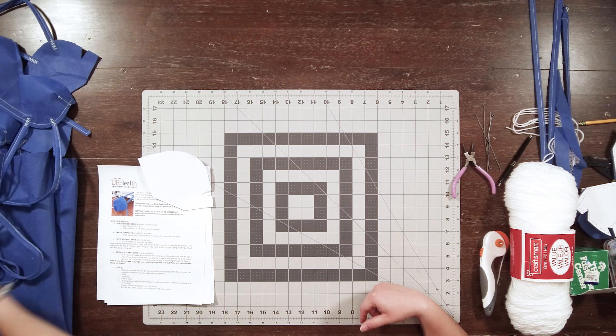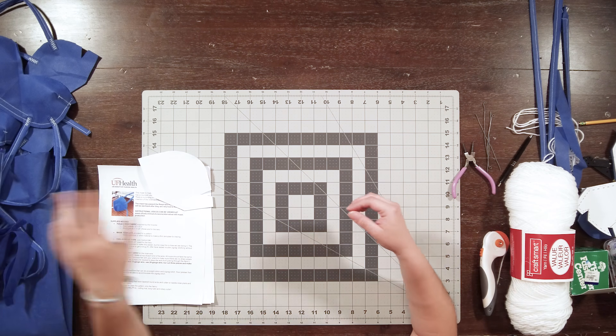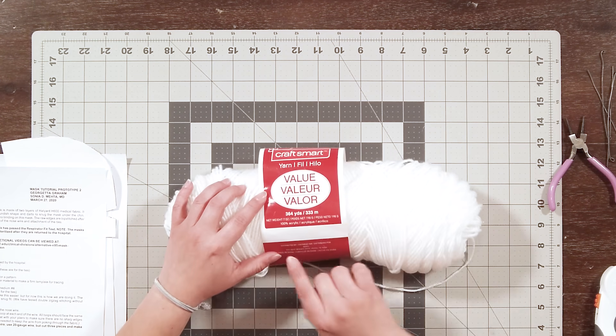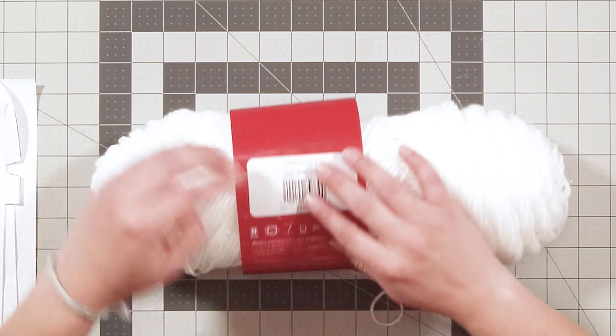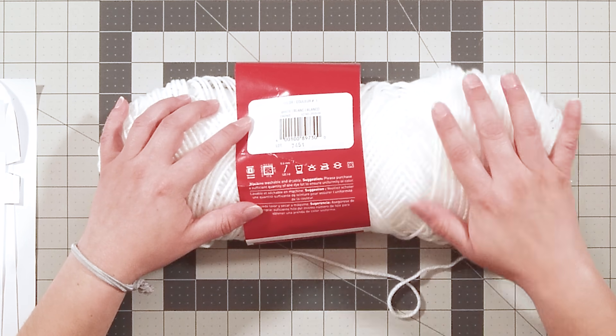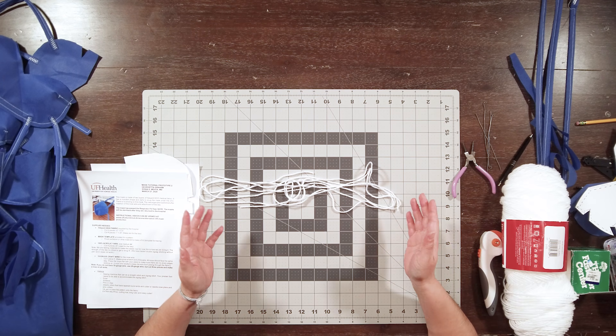The next step was to make the ties themselves — this requires four ties, all one inch wide and 24 inches long. It also calls for eight 24-inch pieces of 100% acrylic yarn. They specifically suggested number four medium yarn. I happened to have this yarn from another project — you can see it's 100% acrylic and on the back of the label it says medium number four, which is exactly what they suggested.